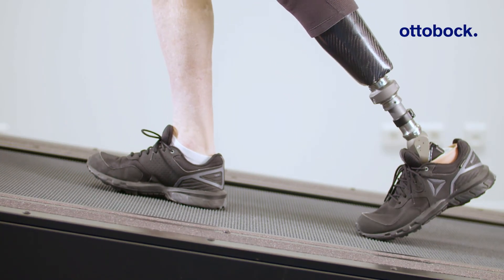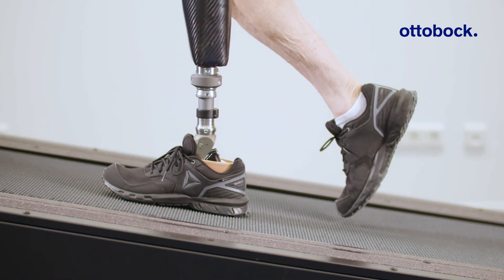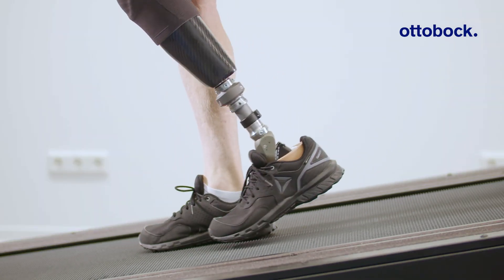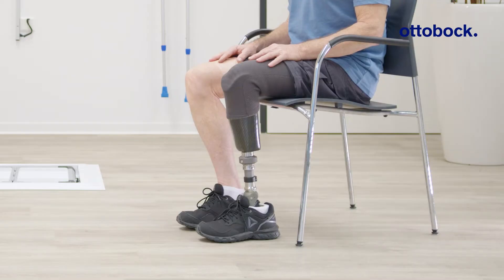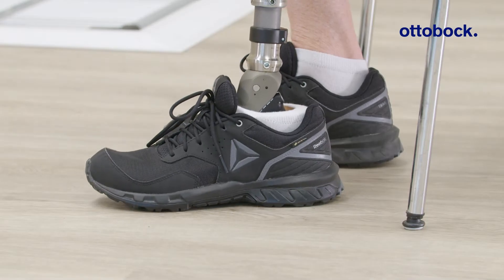When walking on slopes, the prosthetic foot allows for a more natural gait pattern and socket comfort. Walking down slopes becomes more controlled, and the ankle joint allows positioning the foot more naturally, increasing comfort while sitting.